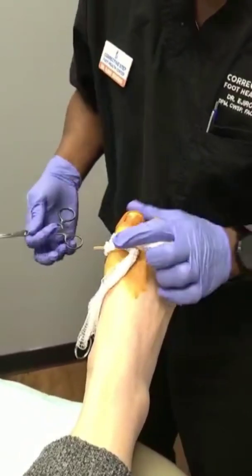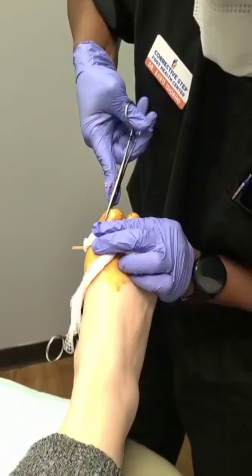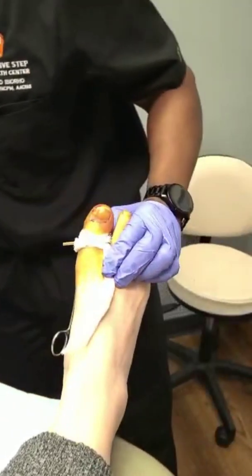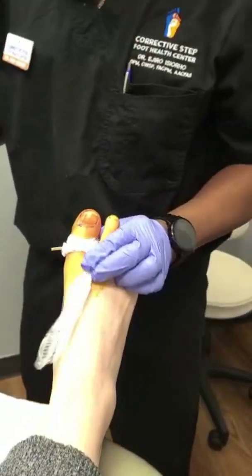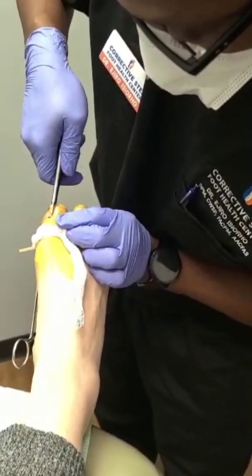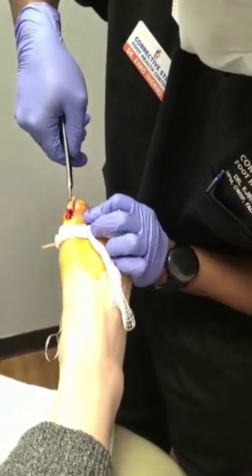All right, now I'm ready for my favorite part. So I clamp it and I'm going to just rotate my hand — and there's an L. Now I know exactly how much I'm going to take out. This is where it curves, so we're going to take out just that portion where it curves.